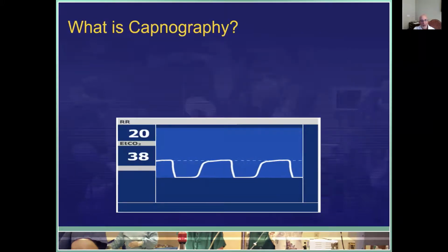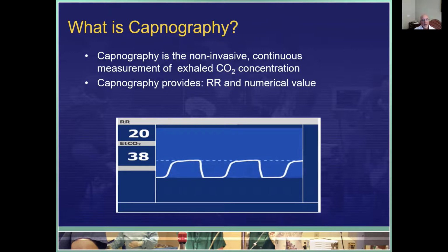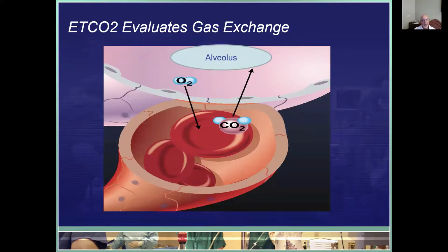So let us review what is capnography. Capnography is a non-invasive continuous measurement of exhaled CO2 concentration. Capnography provides respiration rate and a numerical value which is displayed on the screen. Let us review the use of capnography in the ICU patients, as this is somewhat an uncommon practice in many ICUs. Let us look at what end-tidal CO2 evaluates.